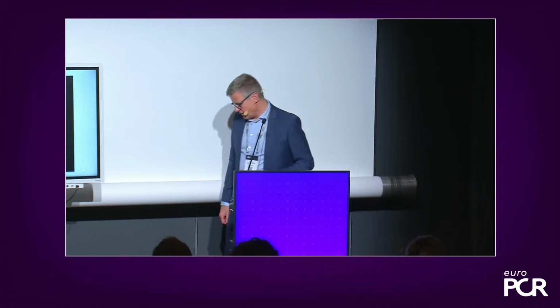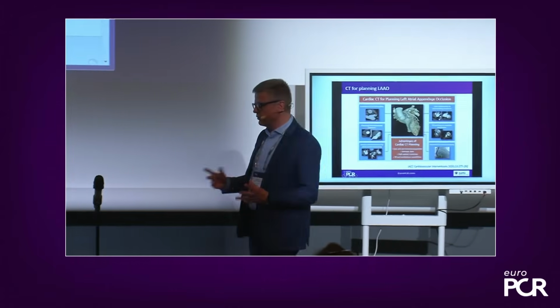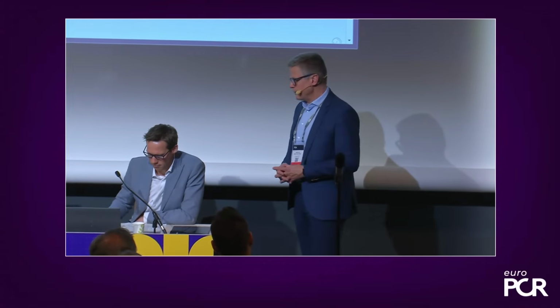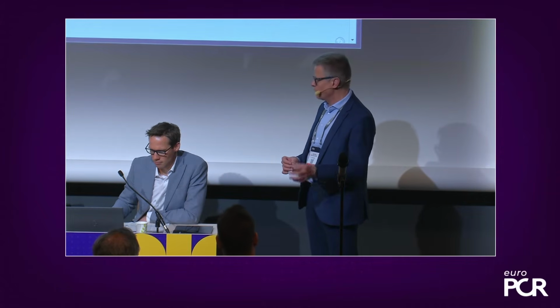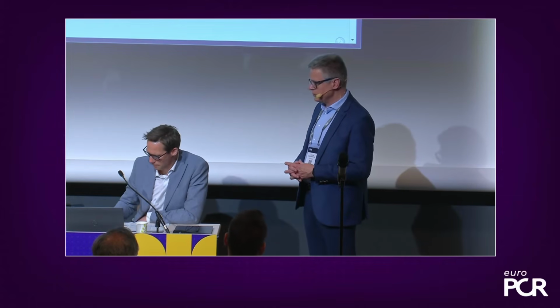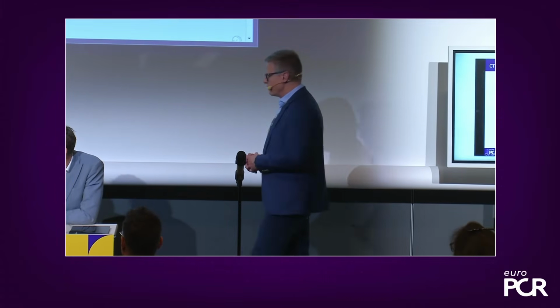Thank you, Lars, that was a great case, and it was a really good demonstration of this fusion possibility that we have when we do pre-procedural imaging. And I liked that you had just the essential structures here: the oval fossa, the disc position, and the landing zone. But could you tell us about the limitations of using fusion?